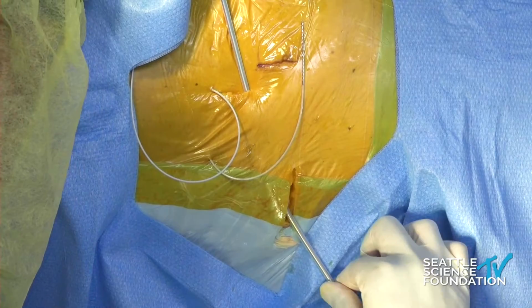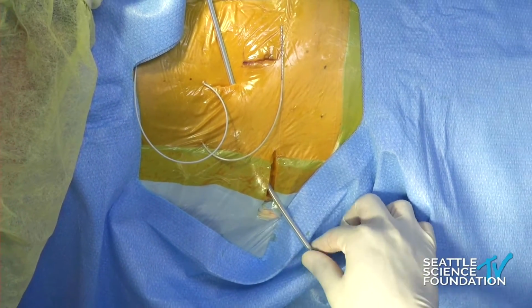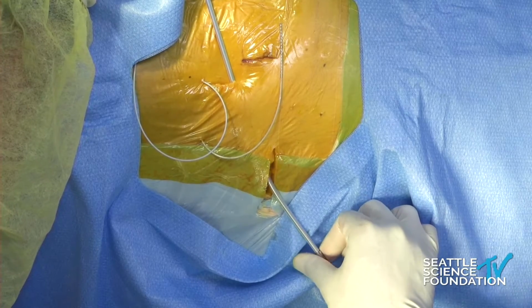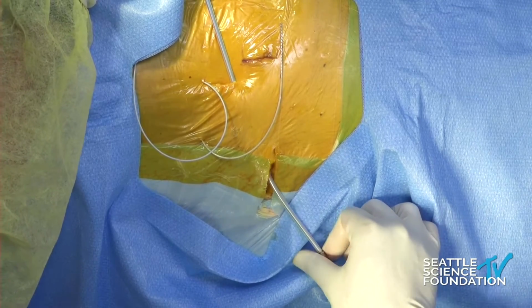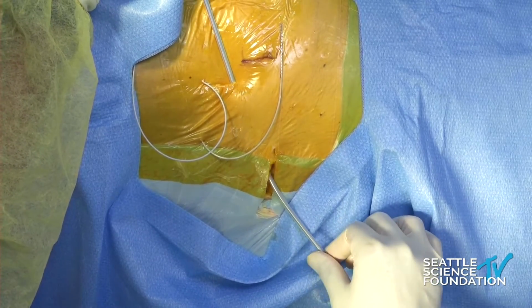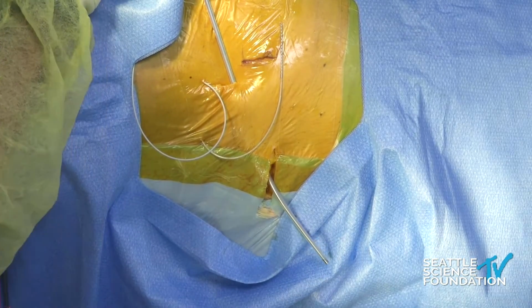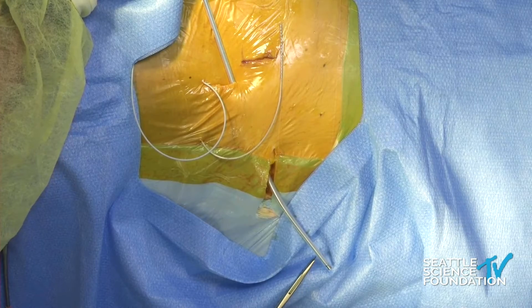Then what we do is, usually you have a scrub tech assisting you here, but you'll wipe your gloves, unscrew this, and then use DeBakey's, which we'll see if we have, which we don't. That's okay. I'll use these needle drivers. Perfect. And we'll grab the straw here and then bring that over.